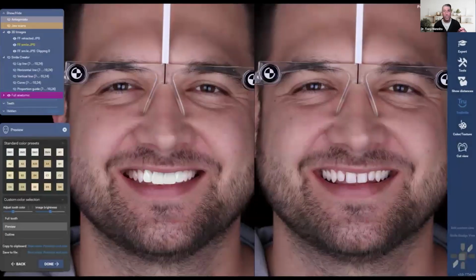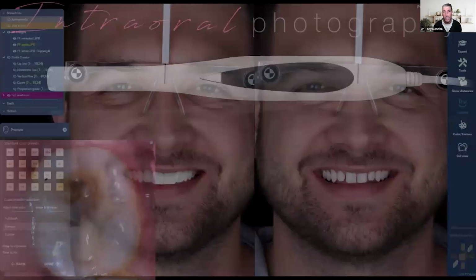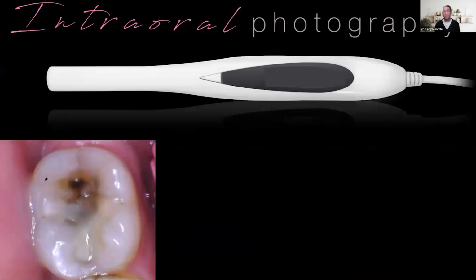This is not quite so photorealistic as we might like to show a patient, but Dom absolutely loves to see this sort of thing because once again, he's a dentist, right? And without photography, you can't necessarily make sure that you're going to get a solid midline on a patient without a cant, especially someone who starts treatment with a cant already in place. So that's one of the benefits that we really realize with extraoral photography.